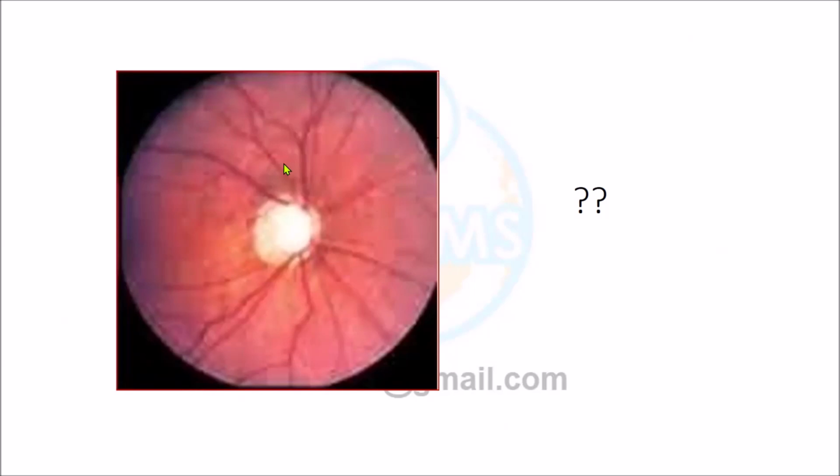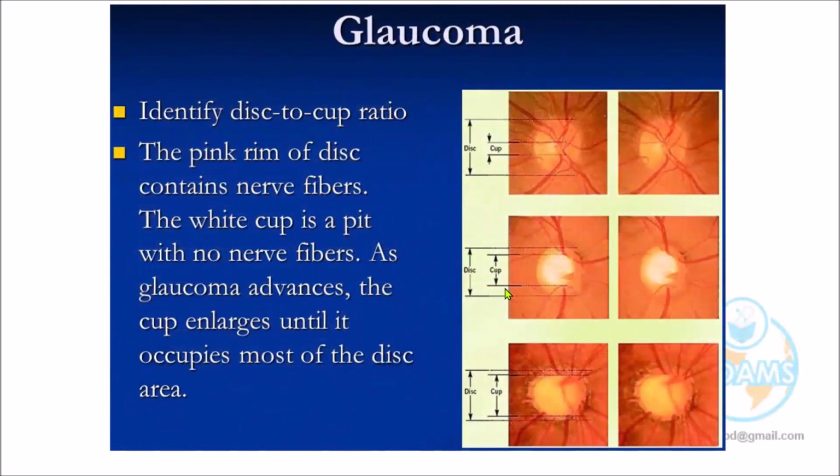And the remaining retina, I'm sorry, the picture is not very clear, but apparently, other than the disc, is there an abnormality in the retina? No. Neovascularization, hemorrhages, nothing there. So this is an enlarged optic cup. Is it more than 50%? Yes. So the diagnosis will be glaucoma.